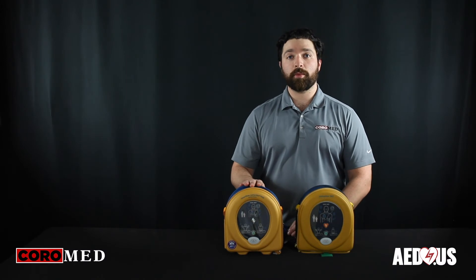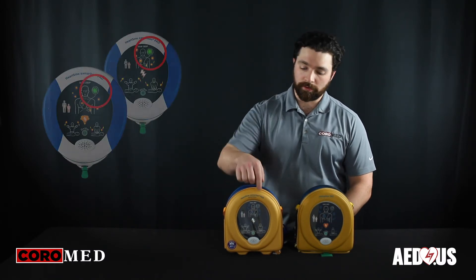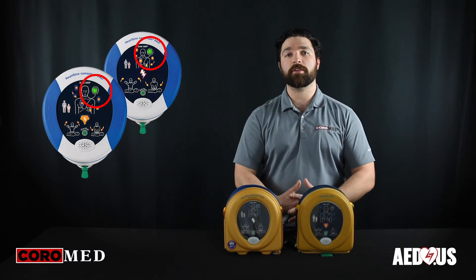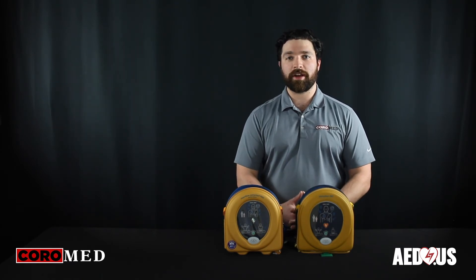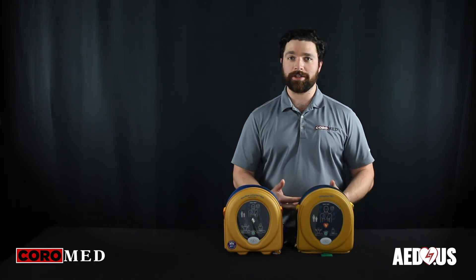The device will perform a weekly self-test with a small light lit up to display if it's rescue ready or not, making it super easy to check that the device is good to go with just a cursory glance.